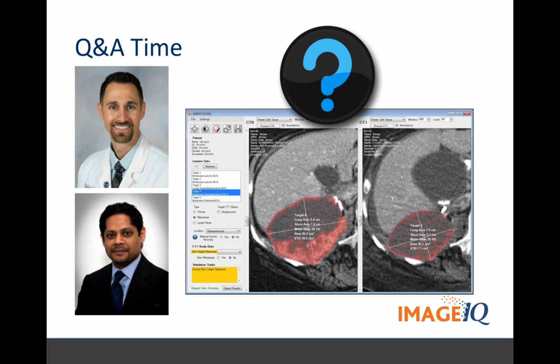The other interesting part about that is the potential for this. This is a Tim question, and it will be the last one, and then we'll wrap up. The potential for doing retrospective analysis. You've done a study, you had it read with RECIST 1.1, and that's what you reported to the agency. But now you want to make a stronger statement in your marketing statements or something like that. The ability to do retrospective analysis on images already acquired would be relatively straightforward, because you could just put them in this and have a team run through it, and you get all that data relatively quickly.